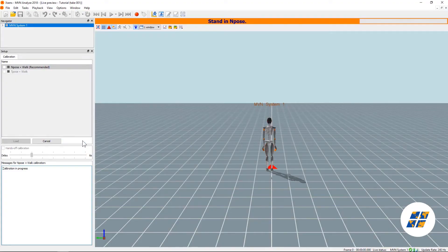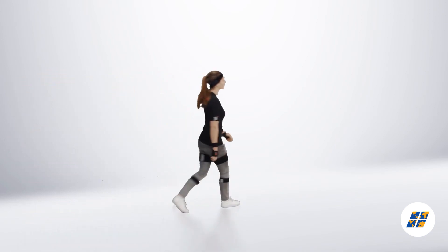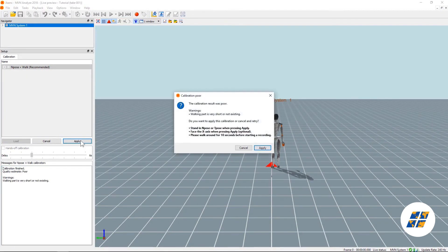Now we can start the calibration. During calibration, make sure the person holds the end pose for about 4 seconds, then walks forwards and backwards in a normal fashion. After the processing of the calibration is done, make sure the person is standing in the x-axis direction you want to define. Once confirmed, hit apply and you can start doing your recordings.